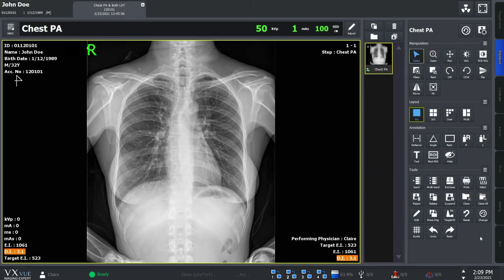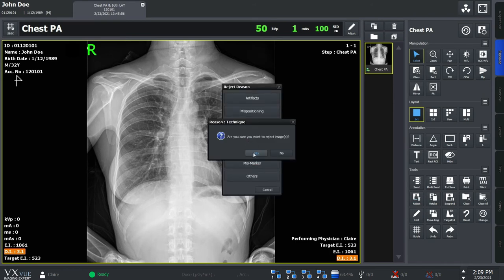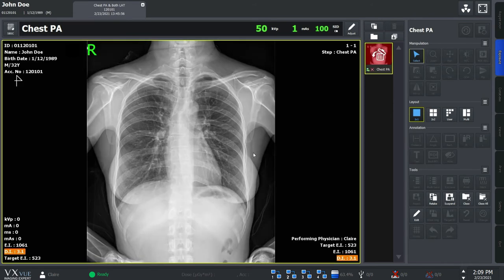When an x-ray image cannot be used due to patient movement or technical issues, you can click reject to indicate you will not approve the image. Click on the reason to reject the study. You will see that the study is indicated in red. Once you've rejected an image, you'll have to retake it.